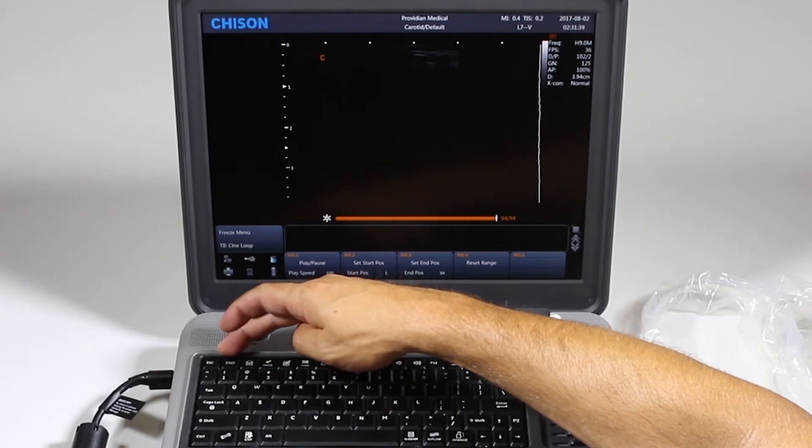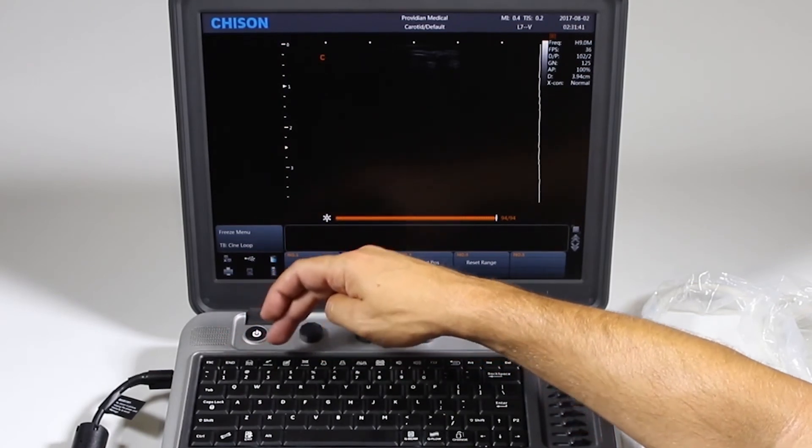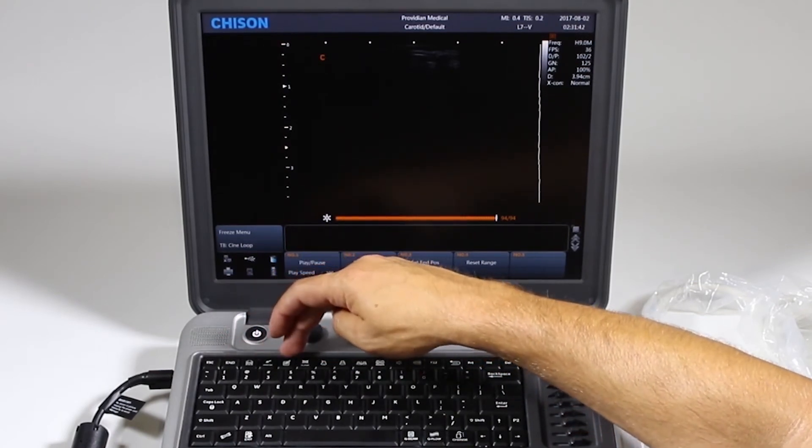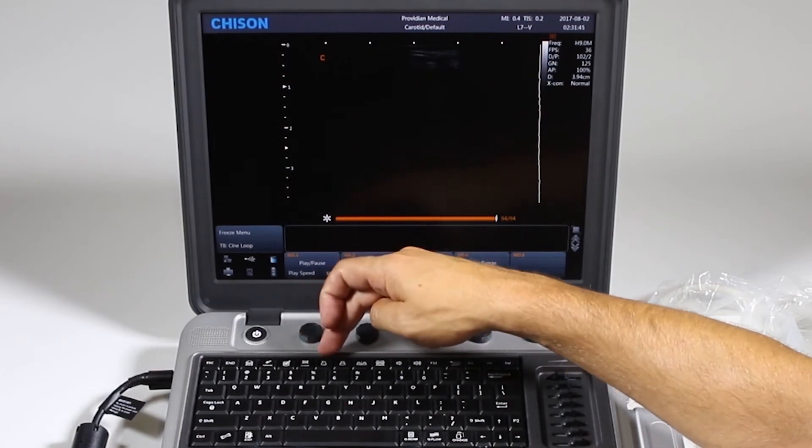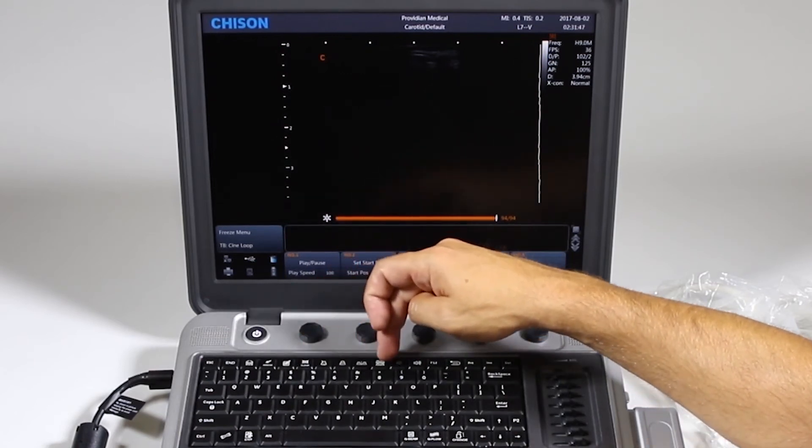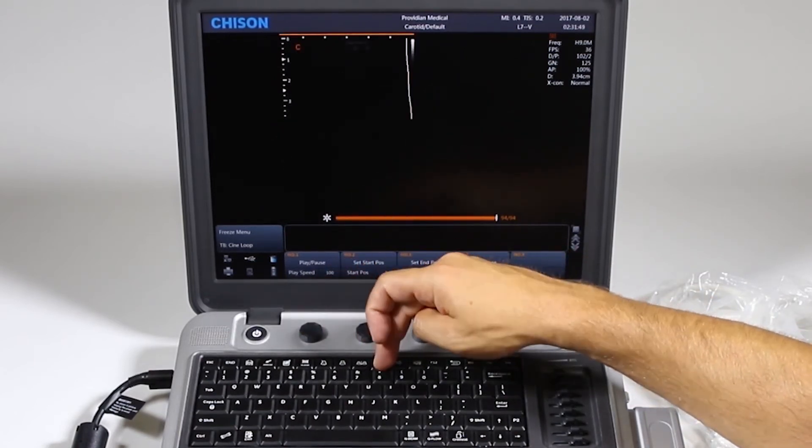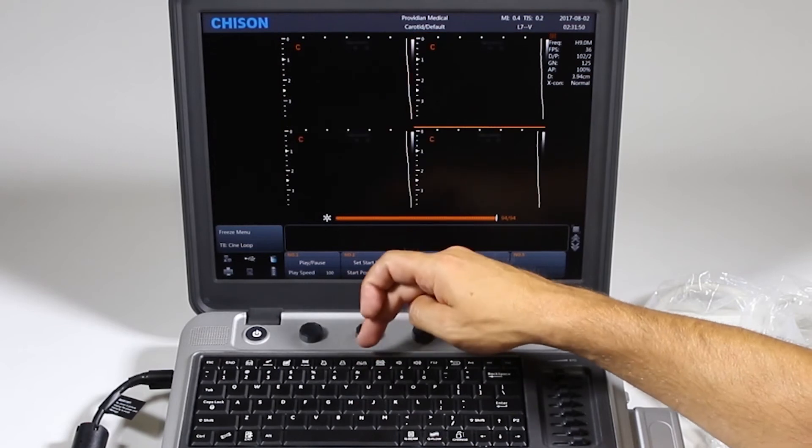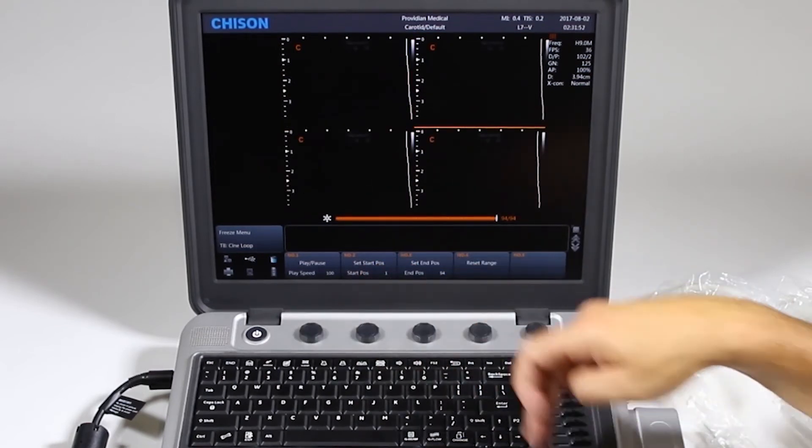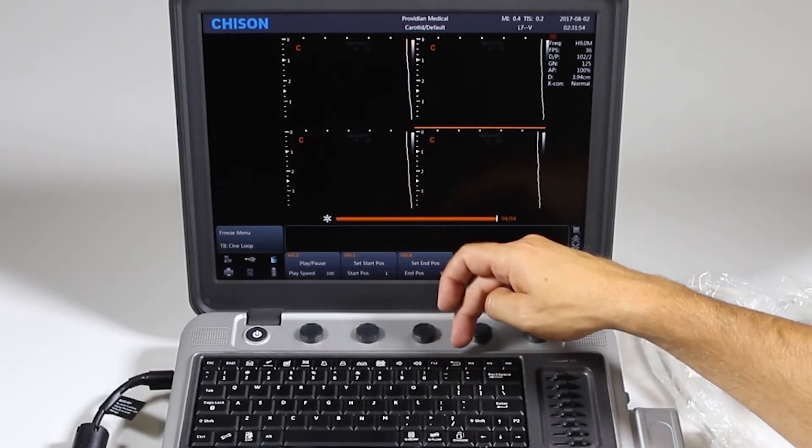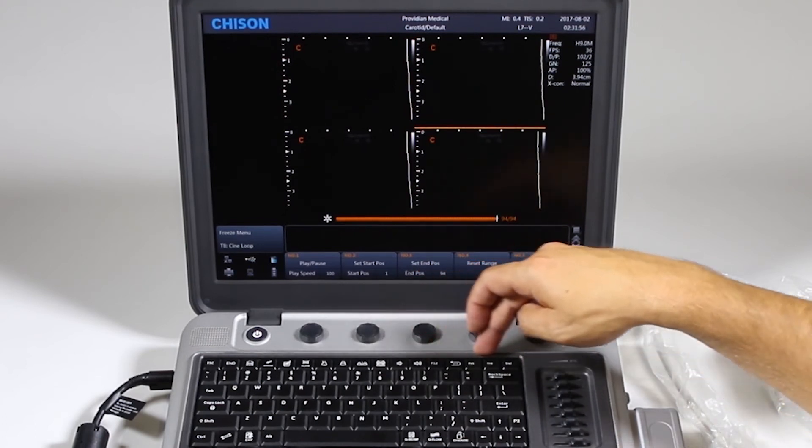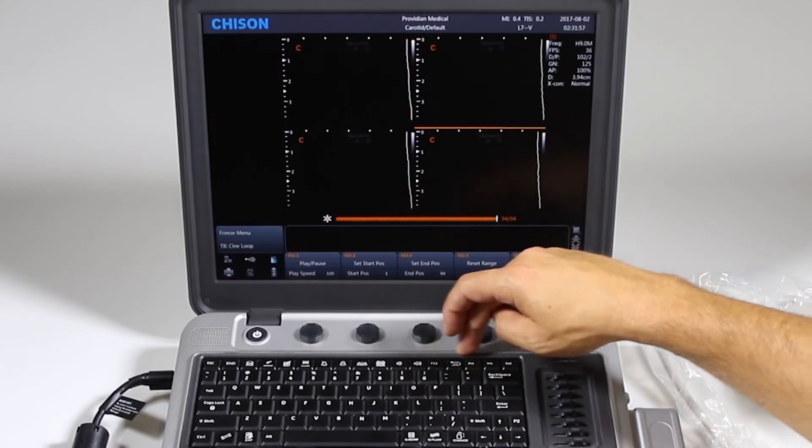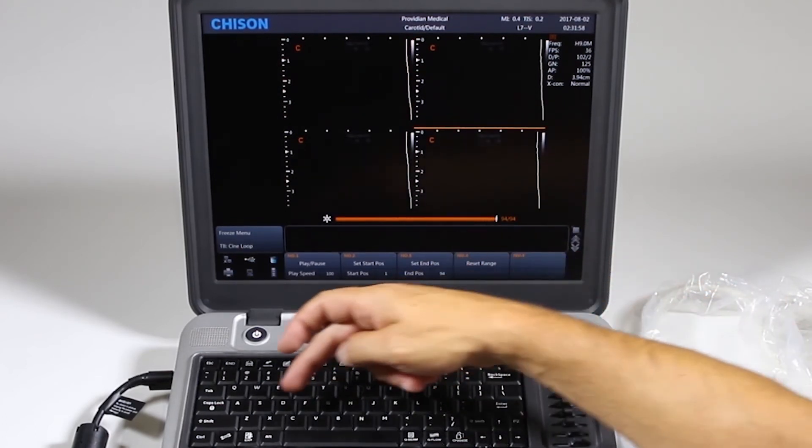And across the top, we have end exam, body marker, arrow, comments. Some of these are repeated. Clear. Your biopsy, single, dual, and quad screen. So you can choose this to go to quad screen. But of course, the single and dual are also right here. Speaker volume. And then these may be programmable keys for the future, but at this time they don't really do anything.